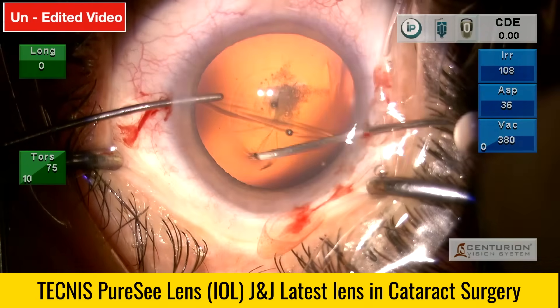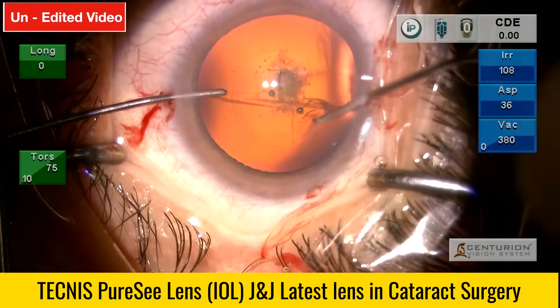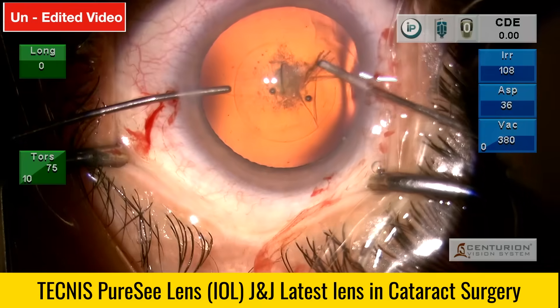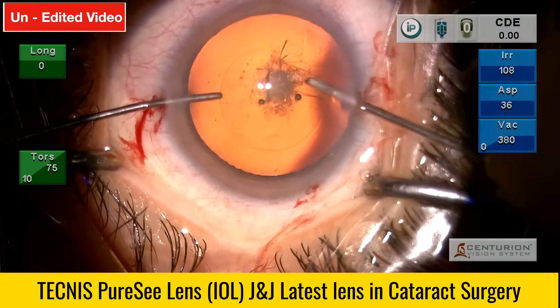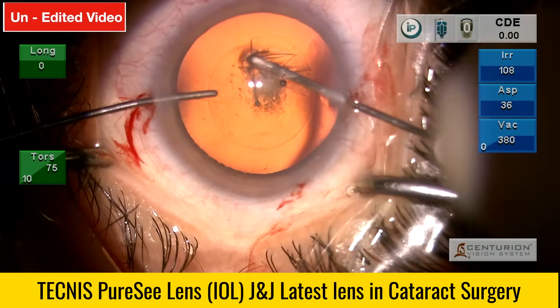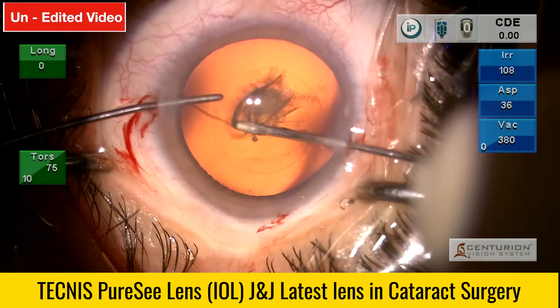Proceeding with the capsulorhexis, trying to keep it at 5.5 mm. The rhexis is being done totally under red reflex, as the lower grade cataract gives a beautiful red glow, making it very convenient. The rhexis is now complete.